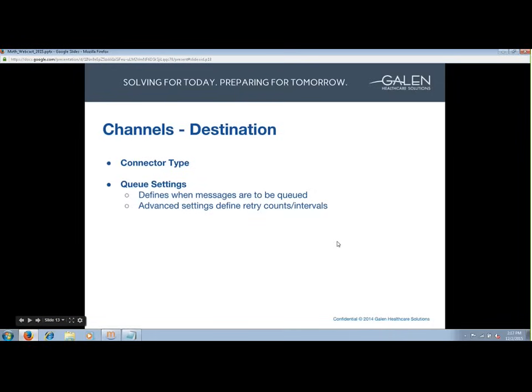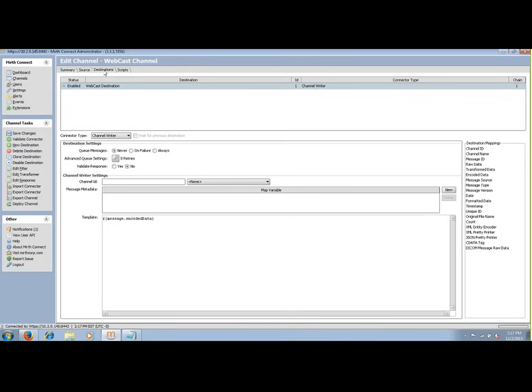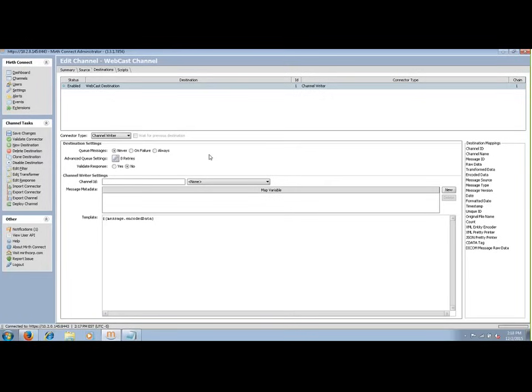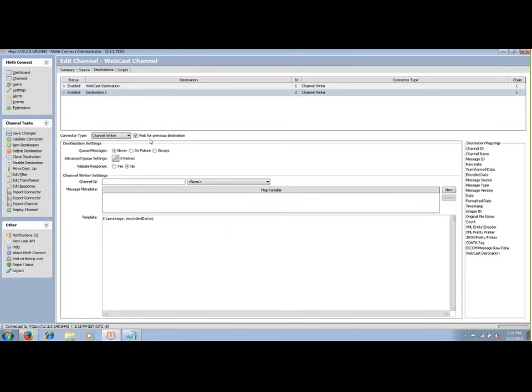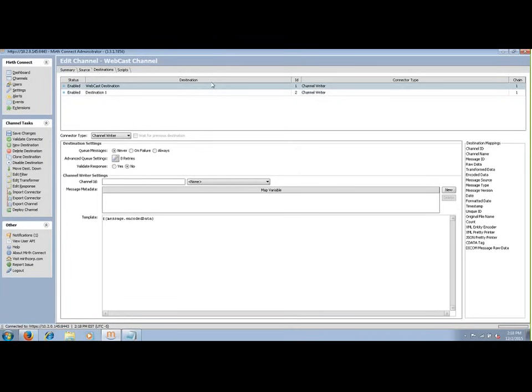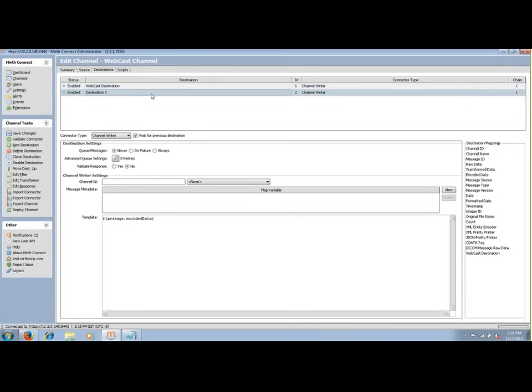Next up is the destination tab. Destinations determine how data is sent from the channel — previously source determined how data is received, destination determines how data is sent. We have the same connector types and can send data out to a database, file, TCP, etc. We can also have multiple destinations in a channel. When you add one, a checkbox appears: 'Wait for previous destination.' This is important if you have an order of operations to follow — for example, the first destination may add a value to a dictionary table and the second destination references that value.